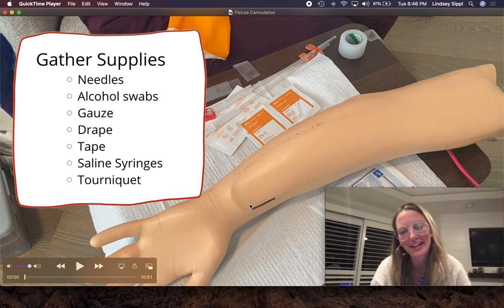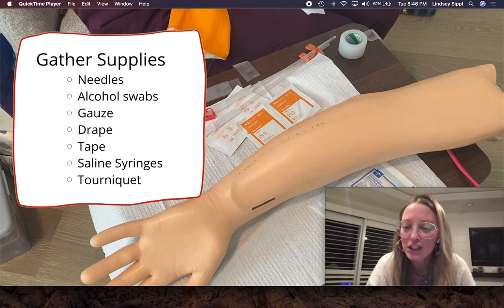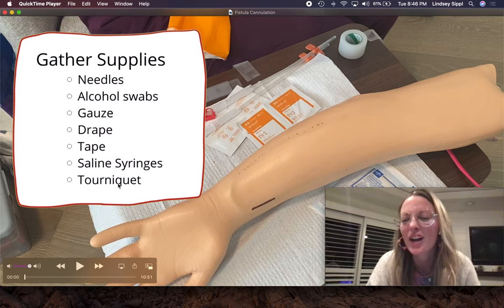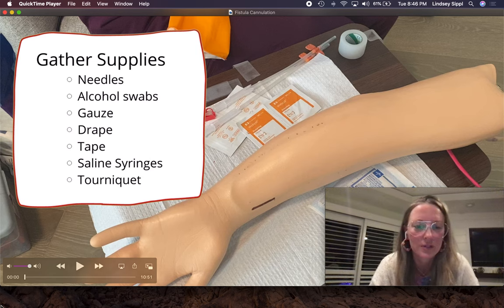This video covers the step-by-step on how to cannulate a dialysis AV fistula. I'll also show you different ways to tape those needles down, and then after all that hard work, I'm going to remove those needles.